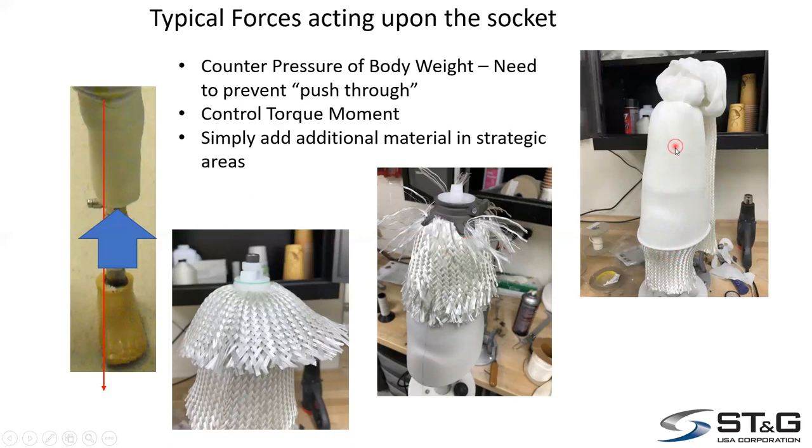You'll notice there are two layers of Nyglass that we're putting on there just to increase some of the I-beam effect of the braid. This socket in particular didn't have any tape in it. If you add tape, it'll definitely be even stiffer. And this is some of the things that we're trying to avoid. If we look at the socket, we can see how the component pulled out.